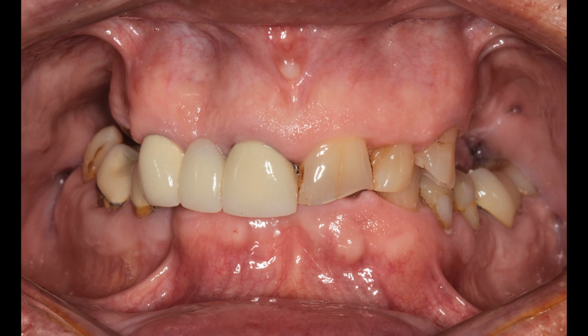This gentleman comes in with what is called a class 2 deep bite, meaning you cannot see his lower teeth at all when his mouth is closed. But what I am looking at that I like a lot is that his bone volume seems to be quite good. His connective tissue or his gum tissue or gingiva, it's called all 3 of those, is outstanding.